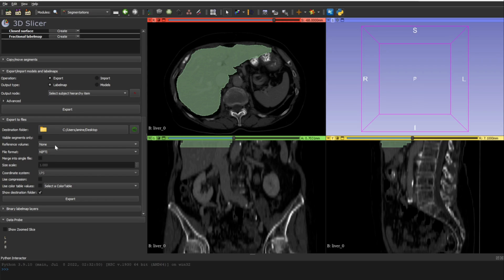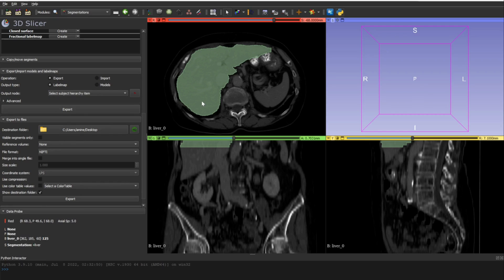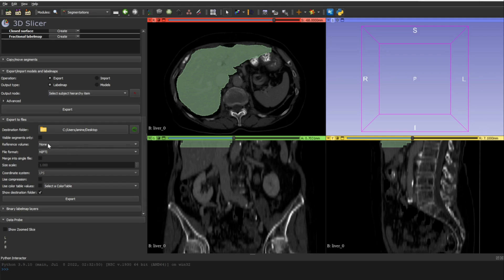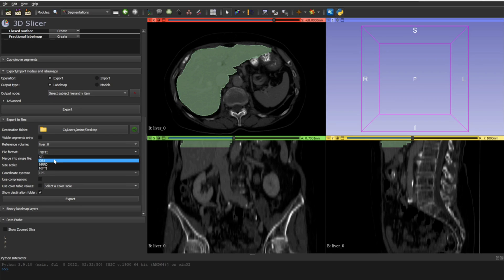If you leave the Reference Volume as None, the exported segmentation file will contain only the three annotated slices. You can open it in Slicer and it will look correct, but in other software the slice counts won't match the original volume. By setting the Reference Volume, the segmentation file will have the same number of slices as the original volume. Then select your file format — usually NIfTI — and click Export. The file will be saved to the directory you selected.